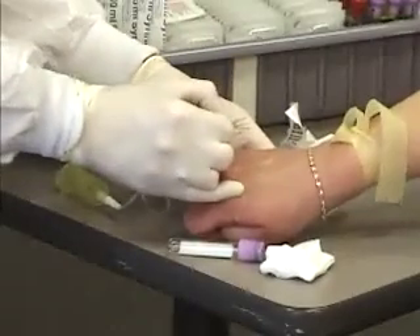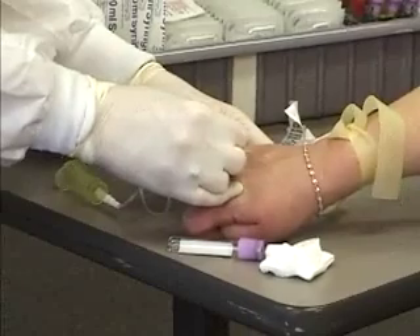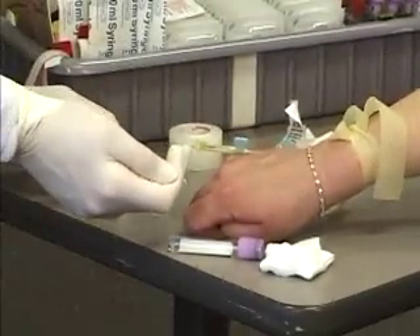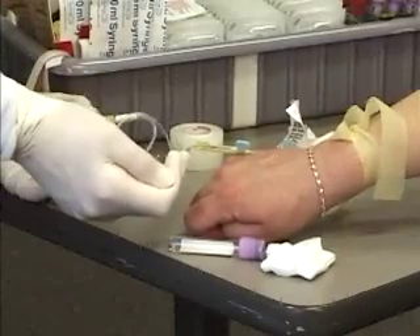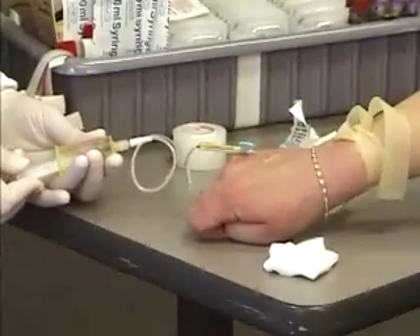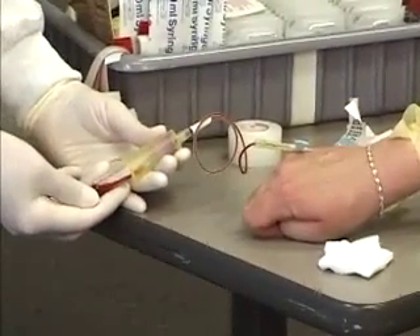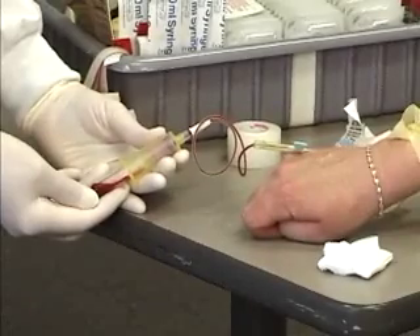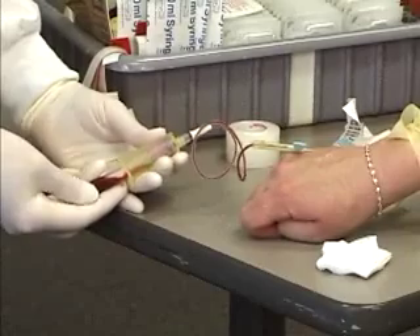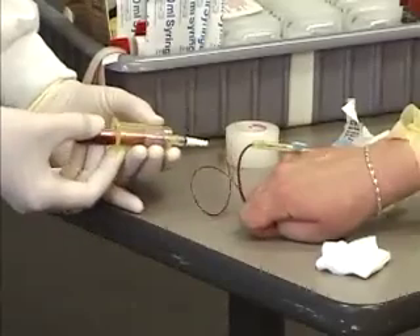You want to make sure that you anchor the vein and that you enter the vein in one swift, fluid motion. With the butterfly, you're going to see the backflash into the tubing before you ever even put your tube on the vacutainer holder. The blood will start coming into the tube. This is a 3 ml tube, so it's not going to totally fill, and you can actually be rocking this as the blood's drawing into the tube.